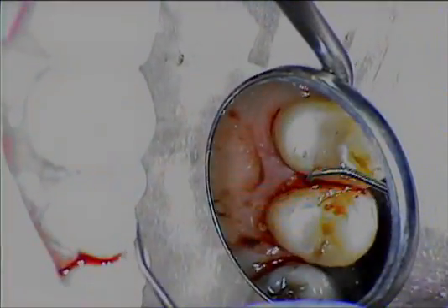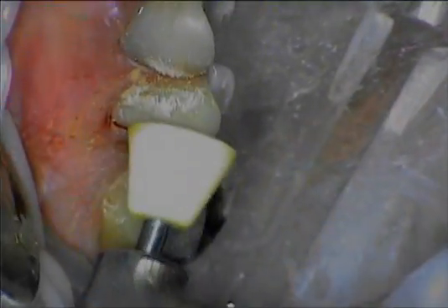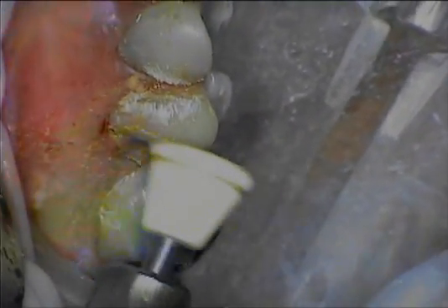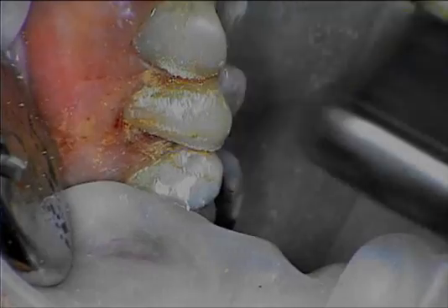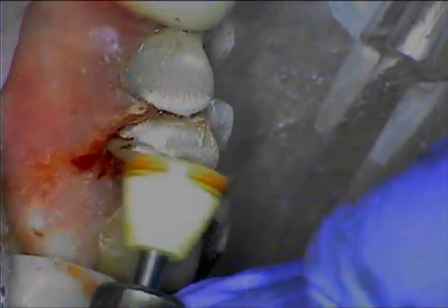You can begin to see how the margins just disappear with the clear nature of the Resoment. Then we'll polish the restoration — most of this polishing is being done to the restoration itself because this is a Paradigm resin block. The Resoment really does not require much polishing at all.